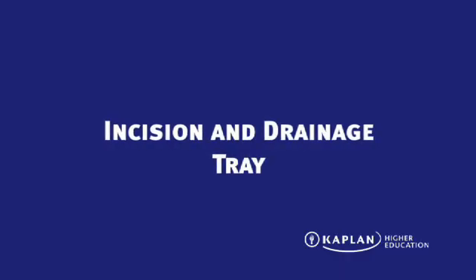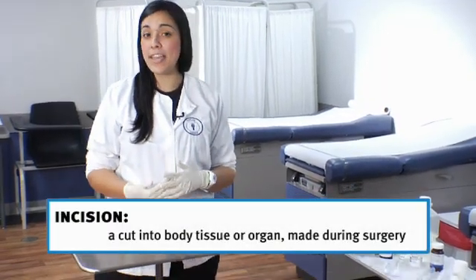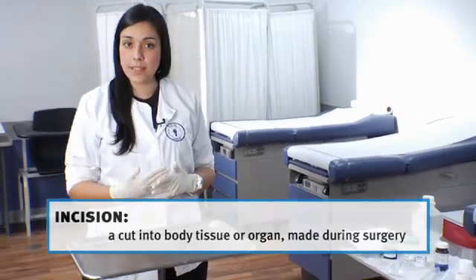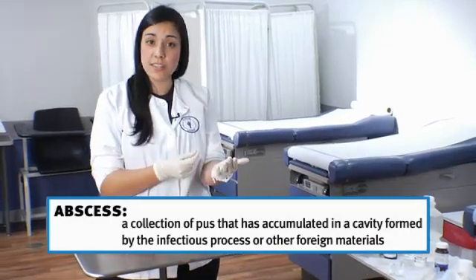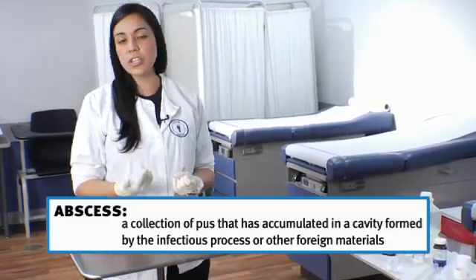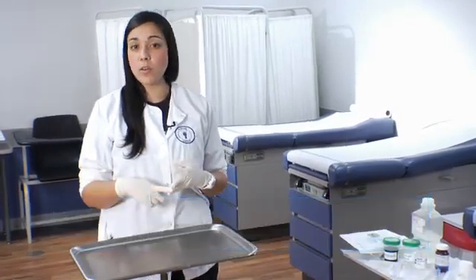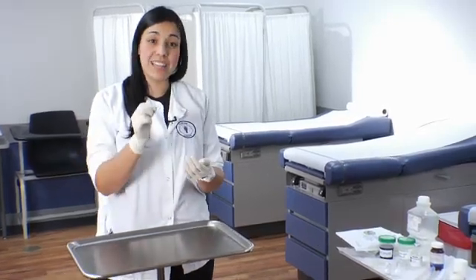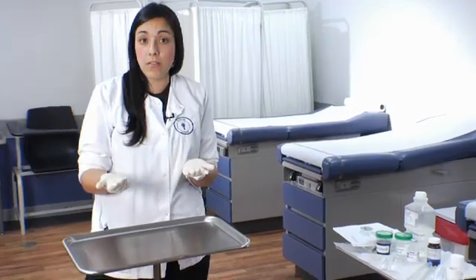The first tray we're going to be doing today is the incision and drainage tray. This tray is usually performed on patients that come in with something called an abscess. An abscess is a little bit of pus accumulated underneath the skin in a cavity, which is usually caused by a local infection, spider bite, infected hair follicle, or some other type of bacteria. The doctor needs to make an incision and drain all that pus out, which can be very infectious.